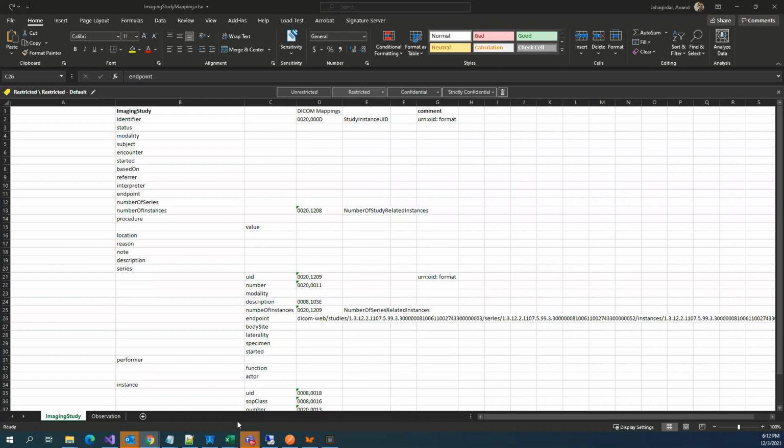Some CDS applications already do it. I mean, we also have a CDS application, clinical decision support system, where we show such findings not directly on images, but as a finding in the application.